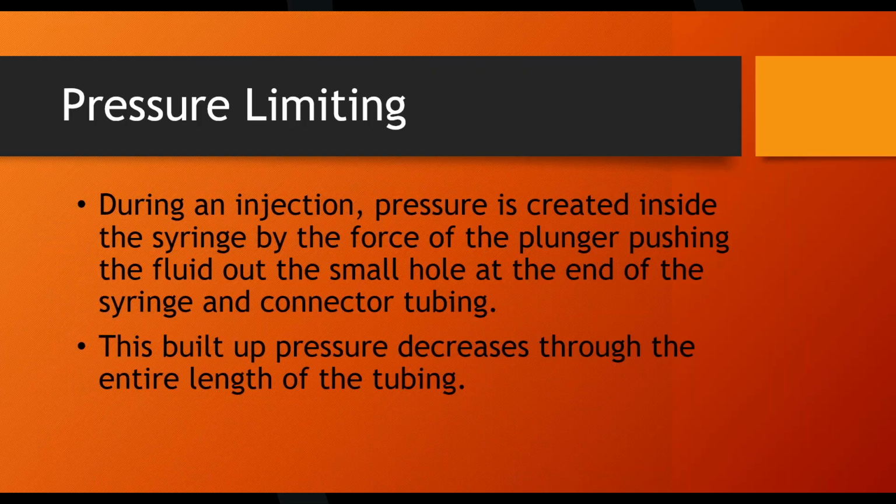What happens is, and it's just due to fluid dynamics, right here in my syringe is about a 1.5 inch wide bore full of fluid, and we're going to shove it out of this little, literally 3 millimeter wide hole out the top here. As you're doing that, pressure will build up in the syringe, as we're trying to get this massive amount of fluid through this tiny little tube to the patient.